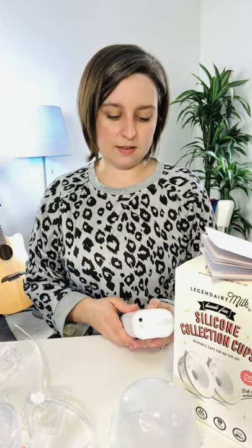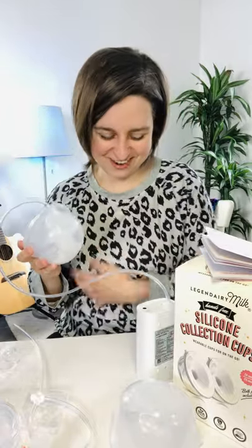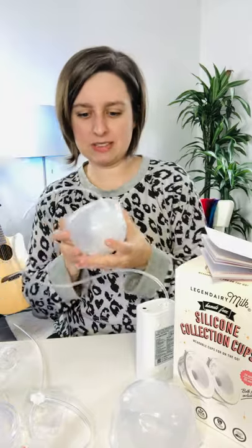I didn't pump that much or that long so let's just kind of see where we're at. My little guy did a good job drinking before his nap. I also had the Spectra turned down really low because it's kind of loud.